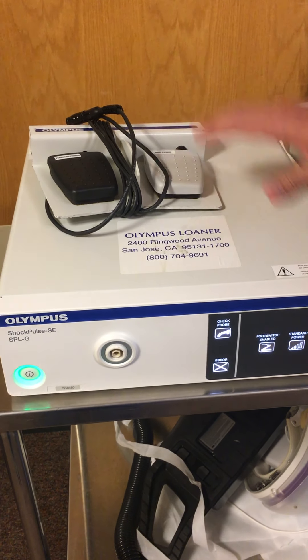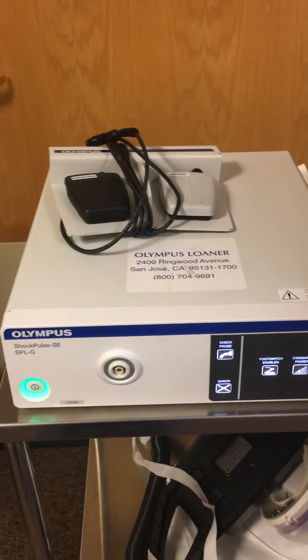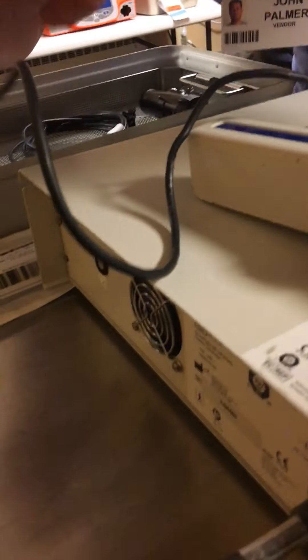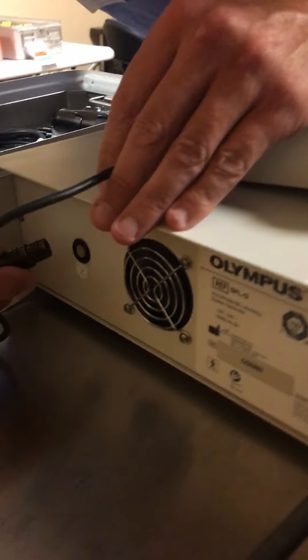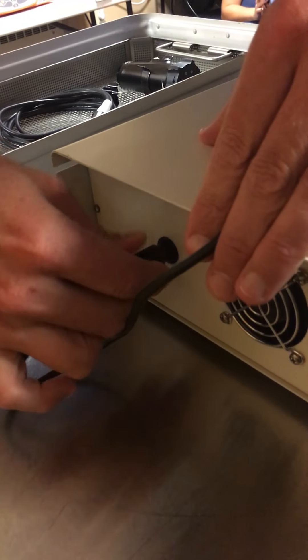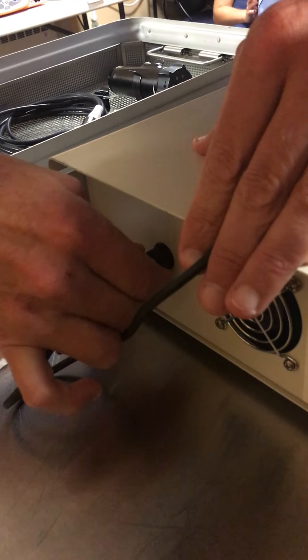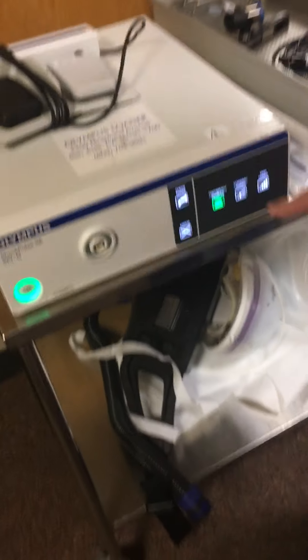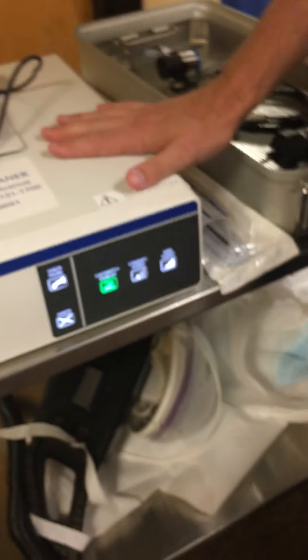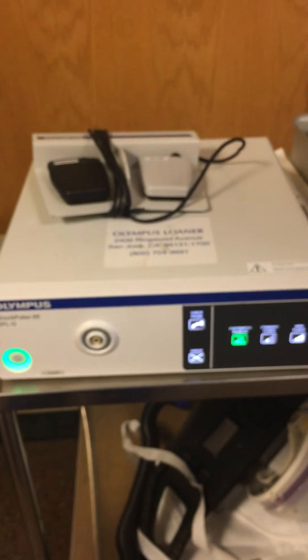We simply attach the transducer, and if we're using the foot switch we'll attach it in the rear. Here's the prong for the foot switch — it attaches to the back right rear panel. There's a red dot and that's going to be at the 12 o'clock position. This will click in nice and firm, and when we do that it will show that we've attached the foot switch.